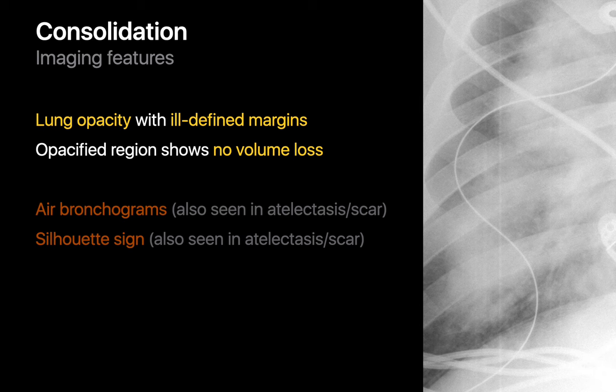Air bronchograms, where air-filled bronchi appear as dark tubular structures against a background of opaque whitish lung, and the silhouette sign, where opaque lung tissue of similar density to the heart and mediastinum makes normal cardiomediastinal borders focally indistinguishable, are features you may encounter with consolidation, but they're nonspecific since they also may occur in the setting of atelectasis or scar.